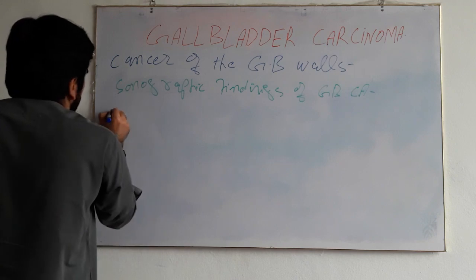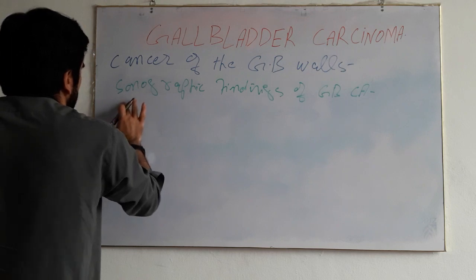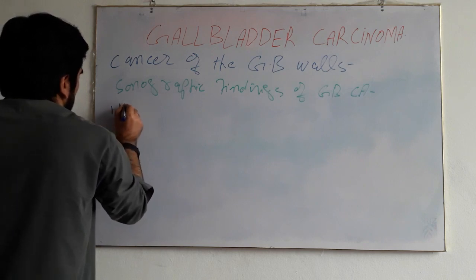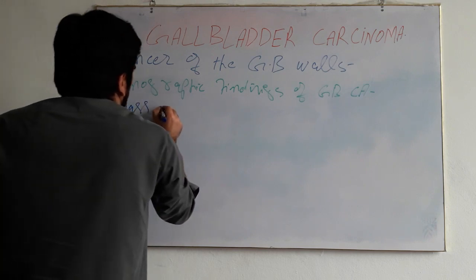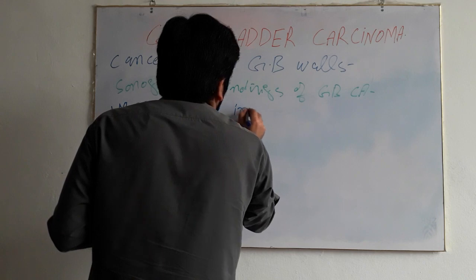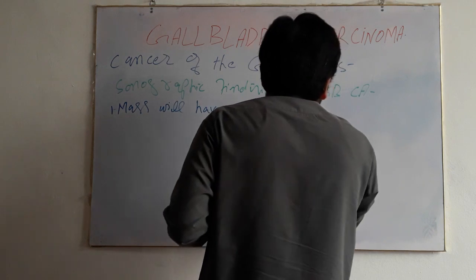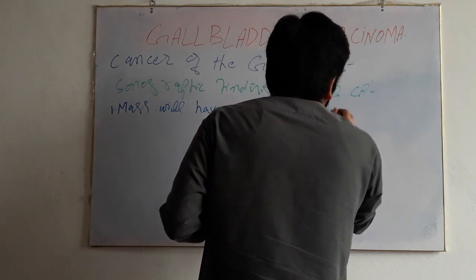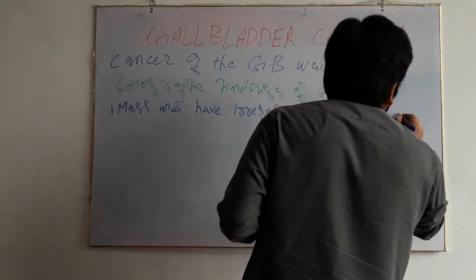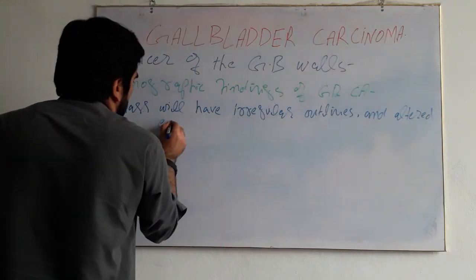First, mass will have irregular outlines or borders and altered echogenicity.